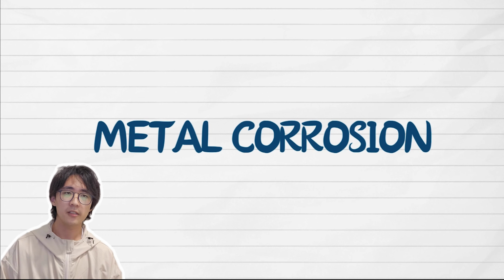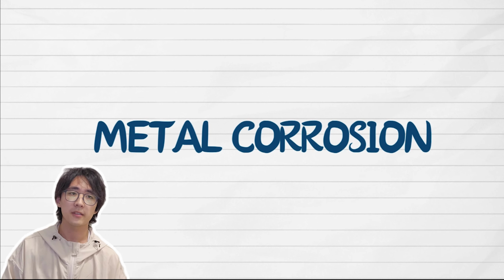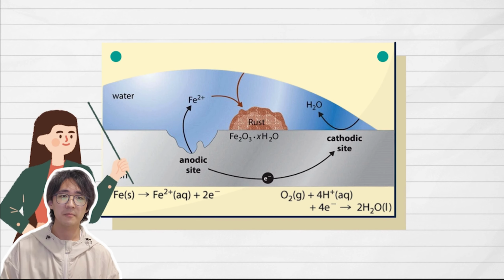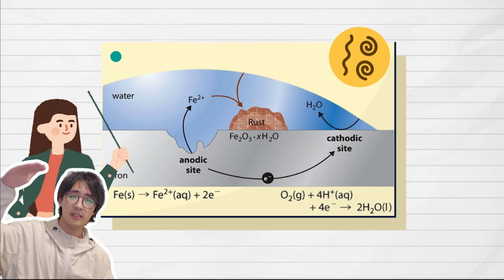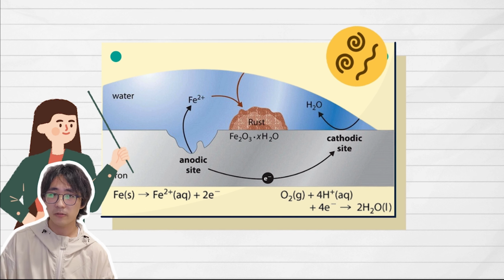Aside from meeting diverse needs of users, one more challenge is potential failure due to corrosion. I won't explain this in detail as your high school chemistry teacher might have explained this thousands of times. Let's go straight to the result. This may damage the protective layer on the surface of the material. You might think, oh, I just prevent it from fluid, it shall be okay. Yeah, of course you can.